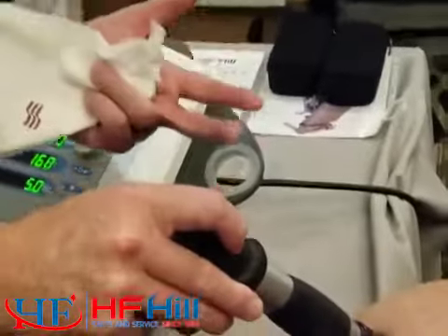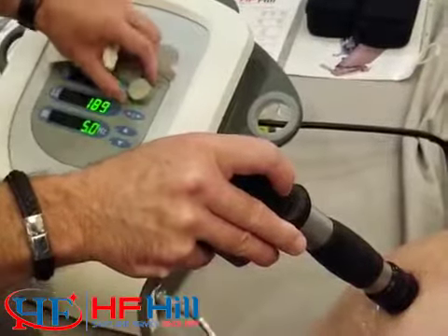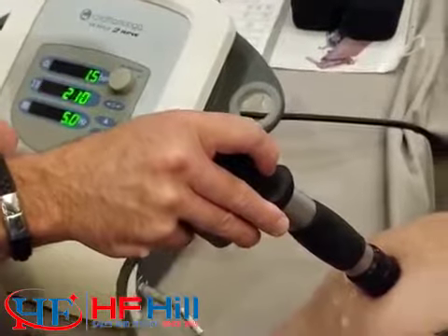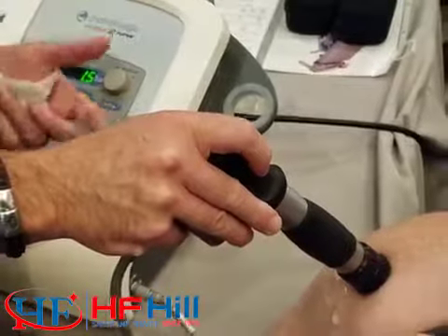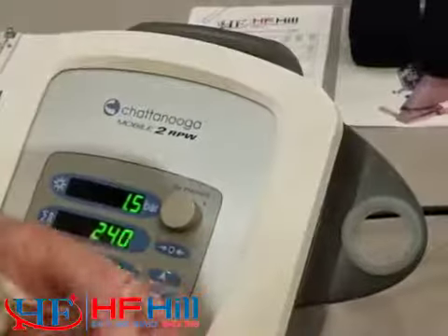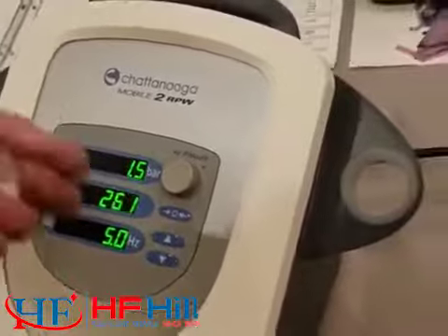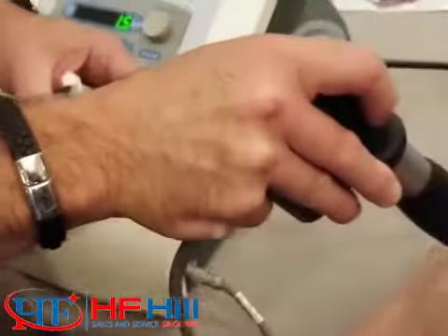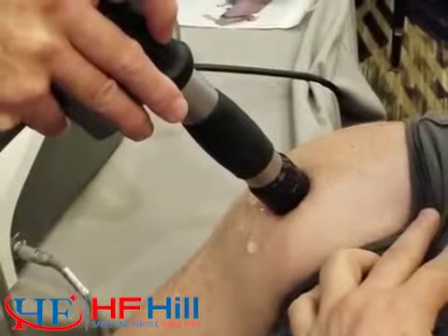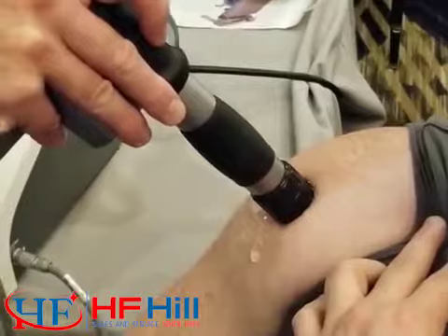So I asked the patient, how does that feel? Pretty good. I can feel it kind of vibrating through the shoulder into my shoulder blade on the backside. There you go. Oh, wow. So now we're up to 1.5 bar. With this particular device, very efficient with regards to the air that it makes. The compressor does a great job, and the seal keeps that air within the system, making it more efficient, allowing for greater energy to be transmitted to this tip right here.